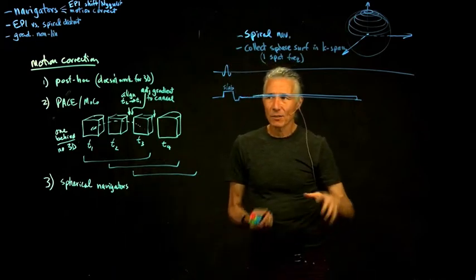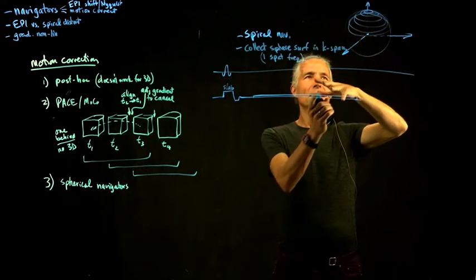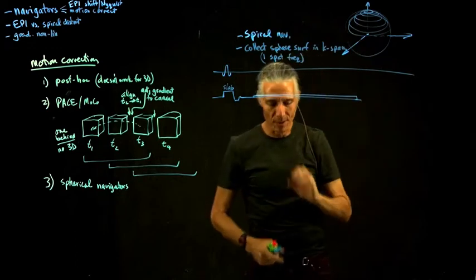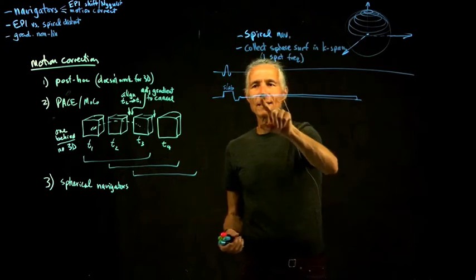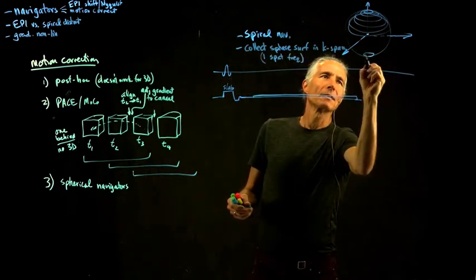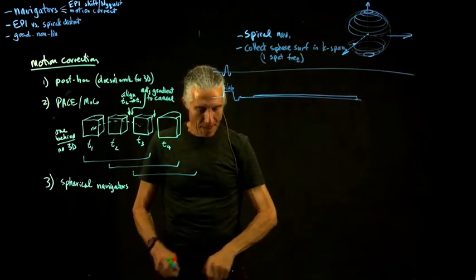So what is it actually? You're stamping on, say, 20 stripes or 50 stripes onto the entire volume, and then you're just sampling all the different possible orientations of those stripes. That's what a sphere in K-space means. So why is this gradient on continuously? Well, that's just to move you. Say we started at the bottom. It's just to move you up the sphere. Slowly move you up the sphere.